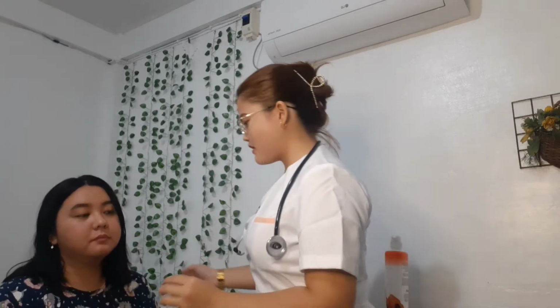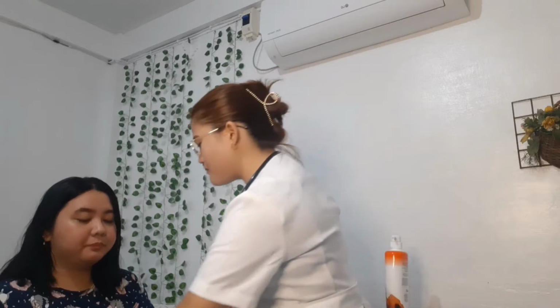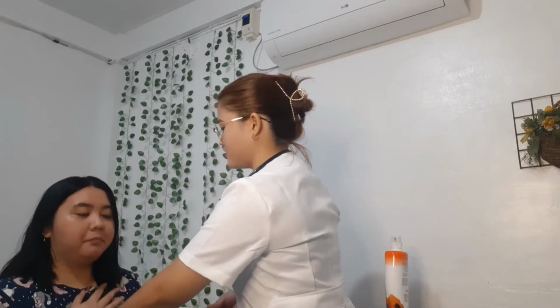Place the other hand near the heart and minimize hand movement in order to get the proper value of the oxygen. So, ma'am, relax lang po kayo. And yung pulse oximeter po ay ipapasok ko sa middle finger. And then, yung isang kamay niyo po ay i-place niyo sa may heart niyo. Okay. After that, you need to record the highest reading that flashes in the pulse oximeter, which is established in 5 seconds, and tell them the purpose of the pulse oximeter.